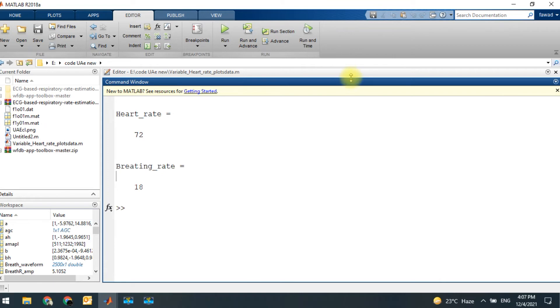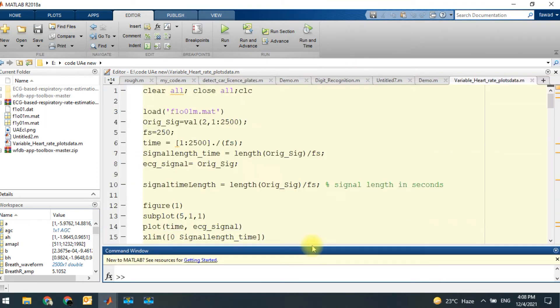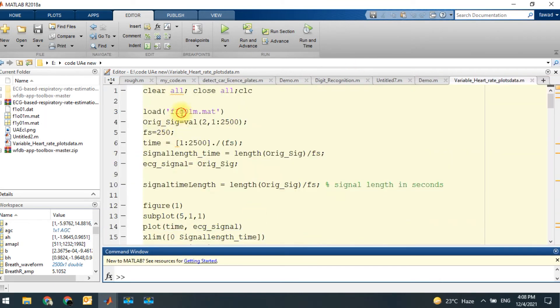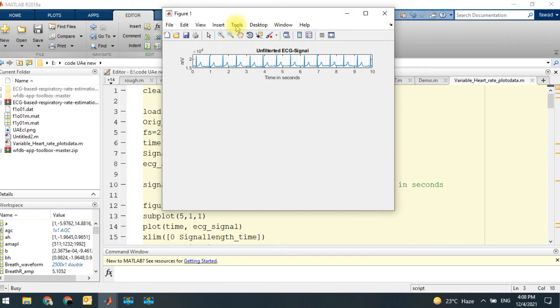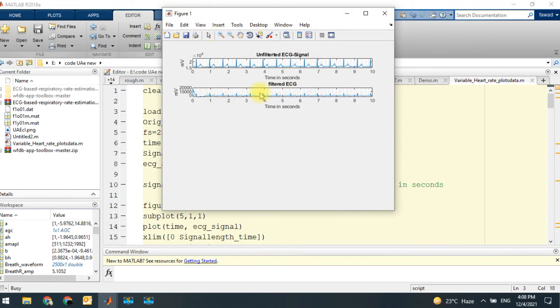If you look into the command window, the total heart rate of this patient is 72 and the breathing rate is 18. I'm going to give another input signal to this algorithm.